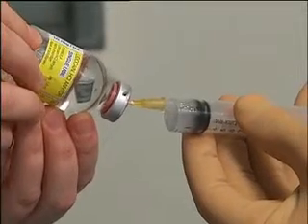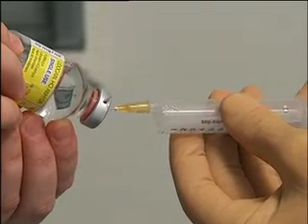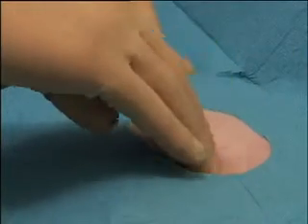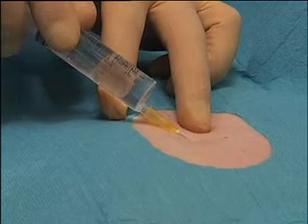Aspirate lidocaine into the 10 ml syringe for use as a local anesthetic agent. Using a 25 gauge needle, inject a wheal of lidocaine at the superior edge of the third rib at the mid-clavicular line.